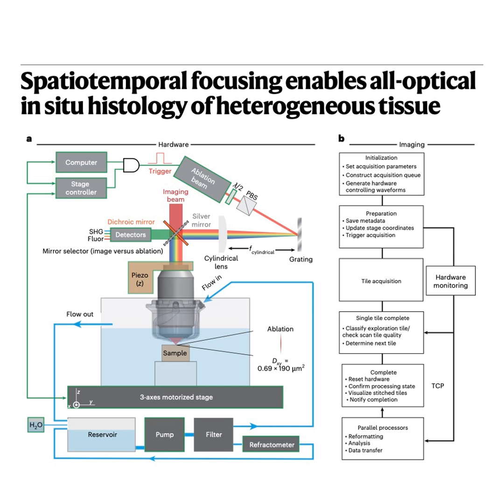Wow, that's relentless self-correction. It really ensures a perfectly flat, clean surface for the next layer. It has to, for the whole process to work over millions of cubic microns. And there's one more layer of monitoring, too. What's that? Continuous hardware health monitoring. Throughout these multi-day runs, the control software is periodically pinging critical hardware components, checking the imaging laser power stability, checking the timing and triggering signals between the lasers, scanners, and detectors.